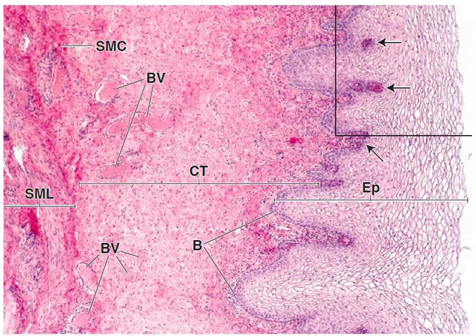The wall of the vagina consists of three layers: a mucosa, a muscularis, and an adventitia. The epithelium of the mucosa is non-keratinized, stratified squamous. It undergoes changes that correspond to the ovarian cycle. The amount of glycogen stored in the epithelial cells increases under the influence of estrogen, whereas the rate of desquamation increases under the influence of progesterone.